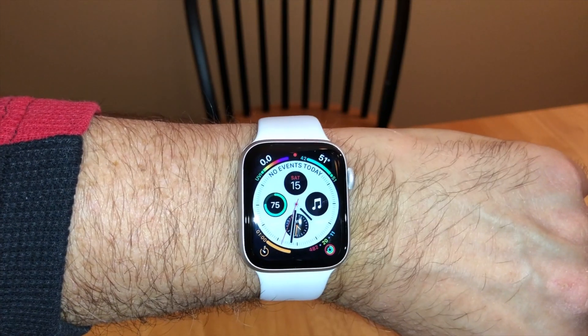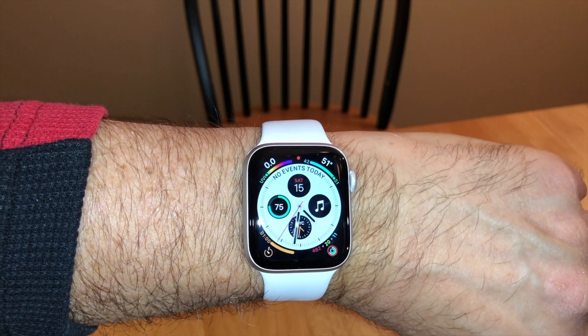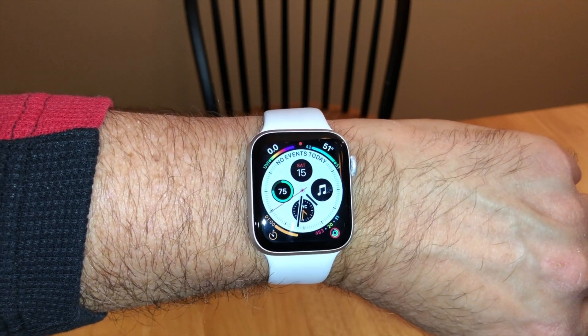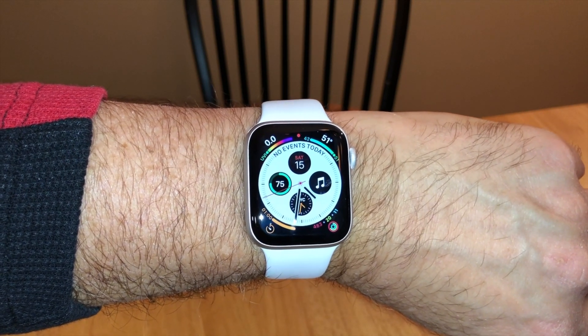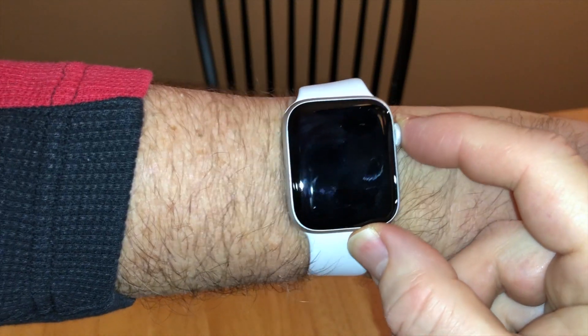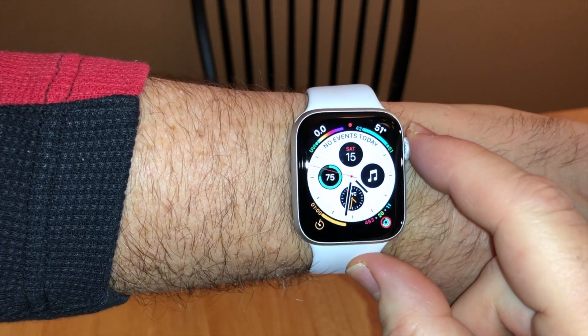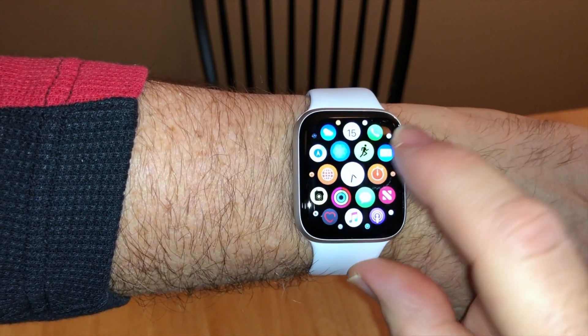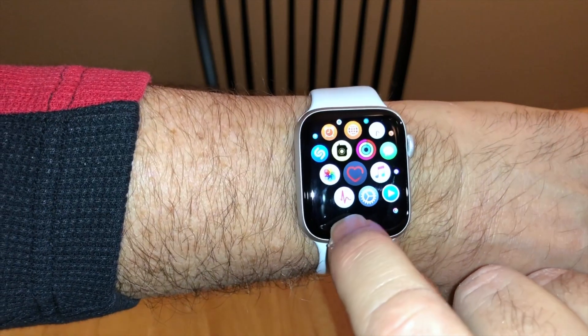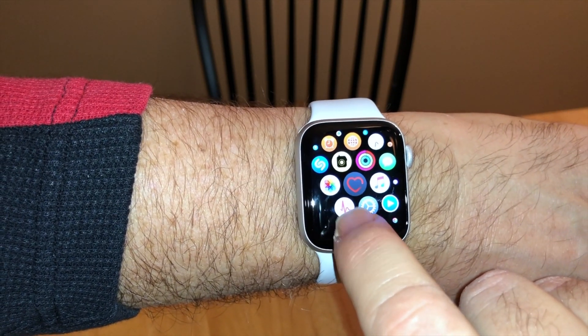I'm going to demonstrate how to use the ECG feature after you have enabled it on your phone. We're going to go to our apps by pressing the crown, scroll down to the bottom, and hit the red icon with the lines.